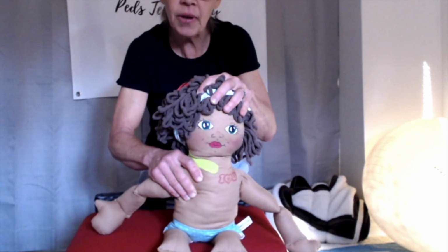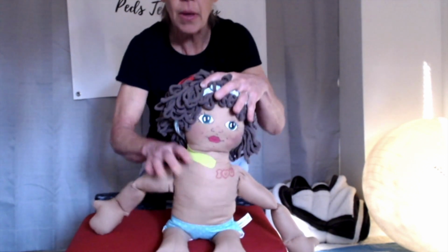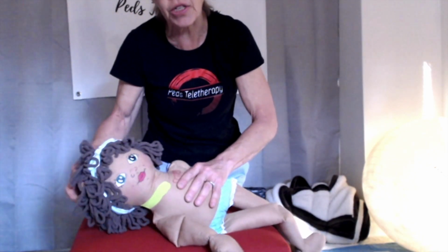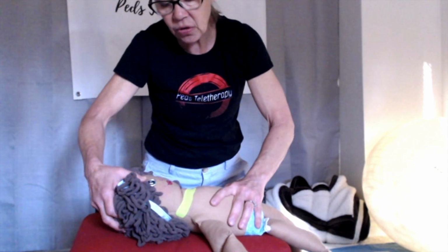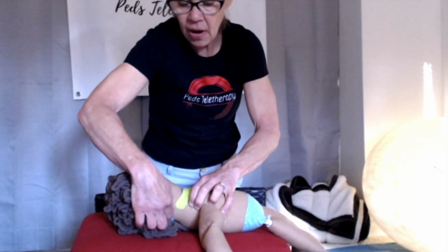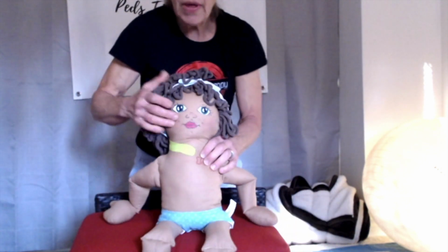I have her sitting up today for this demo, but as you imagine, it's an infant. You wouldn't be taping her sitting up. You'd actually maybe relax that neck ahead of time and stretch it out a little bit, however you've been taught to do your neck stretches. You'd probably have her flat on her back, and somebody could assist you to slowly pull that neck towards the left, maybe rotate it while you applied your tape. Getting the baby's hair out of the way a little bit. Okay, so we do that.